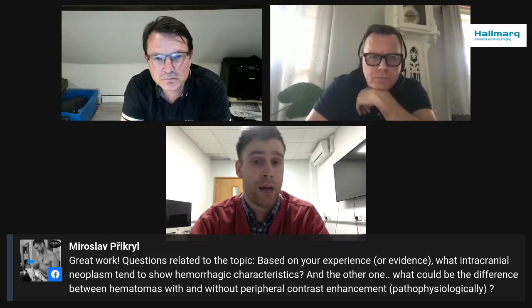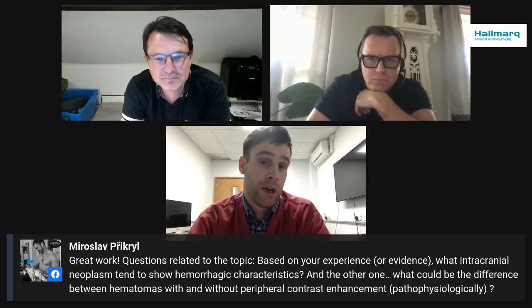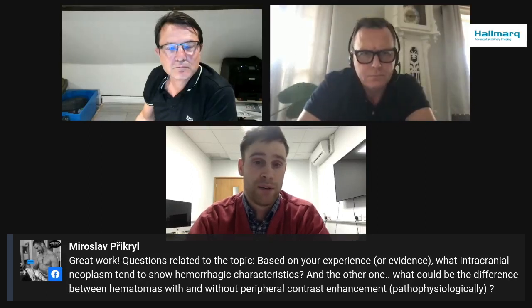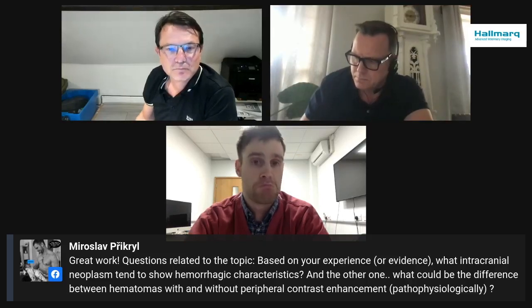I'm not sure when it completely resolves, but in those dogs we're typically imaging 2 months down the line, and we're not seeing any further enhancement with the lesion. So maybe after that 1 to 2 month period, you might not see any further enhancement. During the acute phase, 1 to 3, 4 days, you might not see enhancement, and then in the next 10 to 14 days, you'll probably see enhancement. And as you explained for Miroslav, it's the neovascularization in this capsule that is causing the contrast enhancement. The other question is, what would be the recommended time point to re-MRI this lesion?